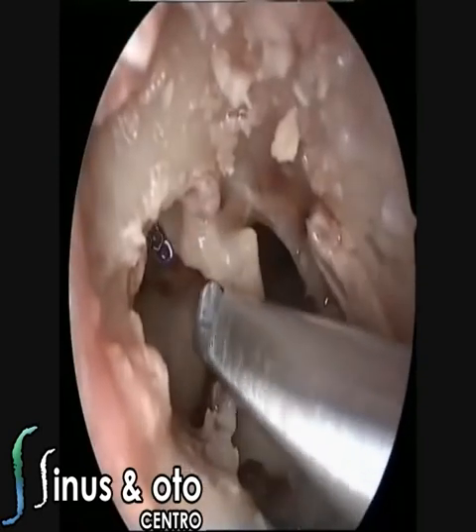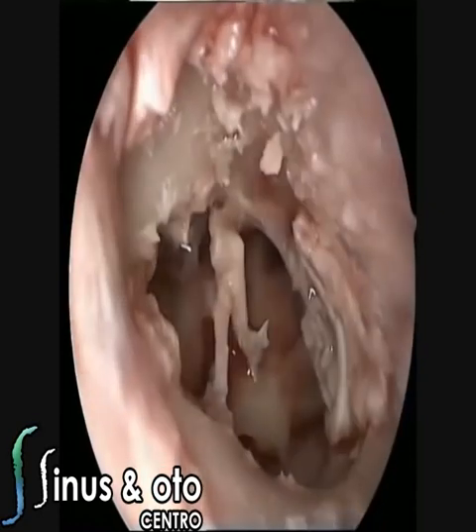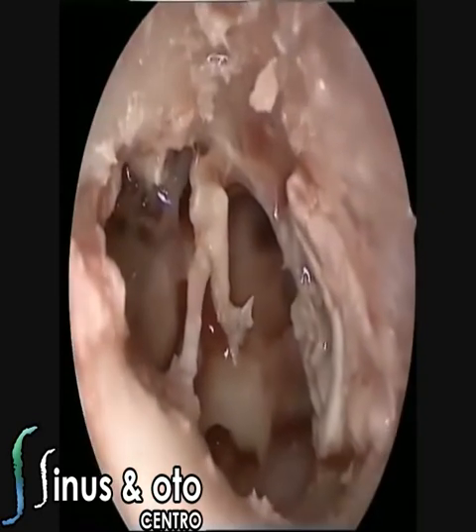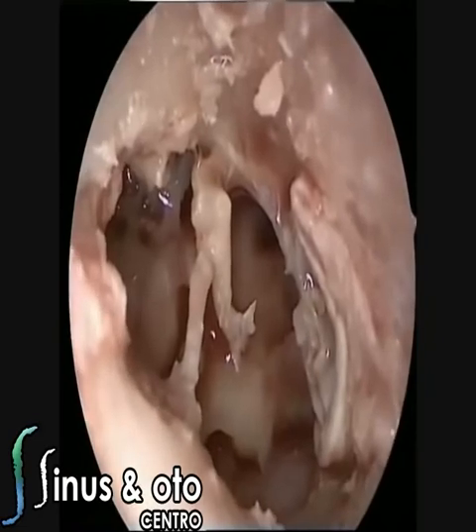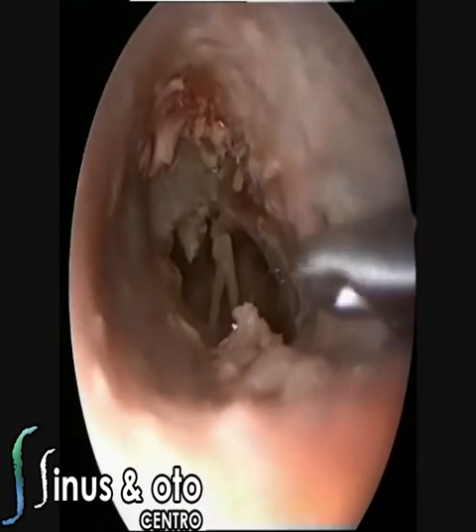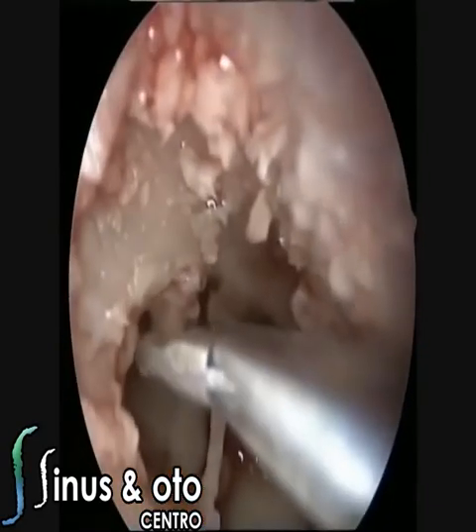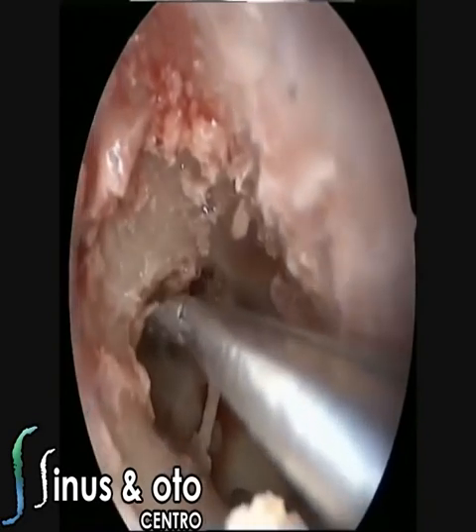So in this case we are also using the malleotomus to remove the head of the malleus. Once you remove the head of the malleus, you open the anterior tympanic spaces better. So you can see the anterior ventilation pathways and the ventilation routes going through the eustachian tube, through the supratubal recess, passing to the area where you can have folds.